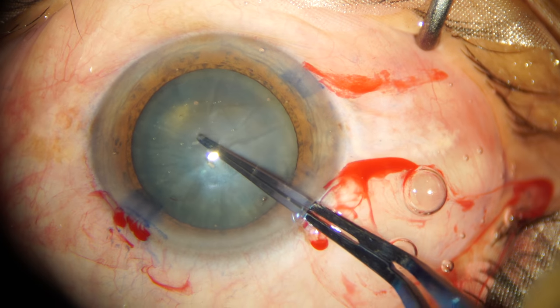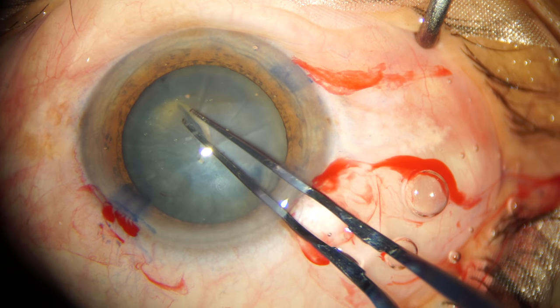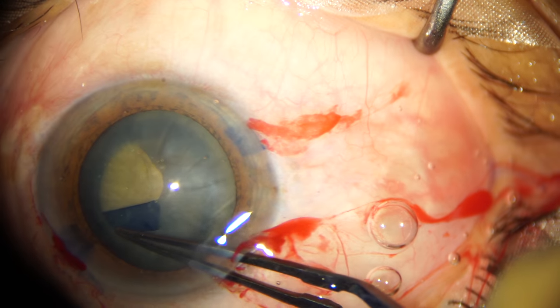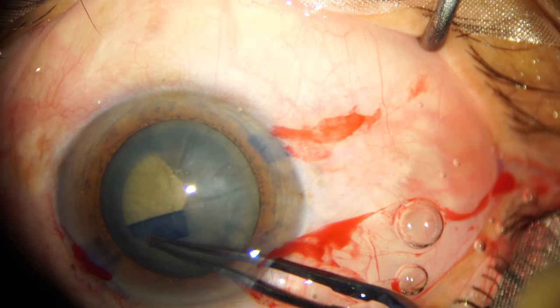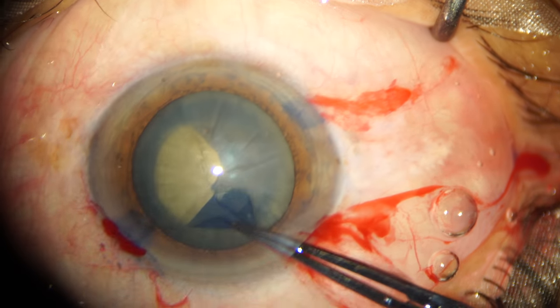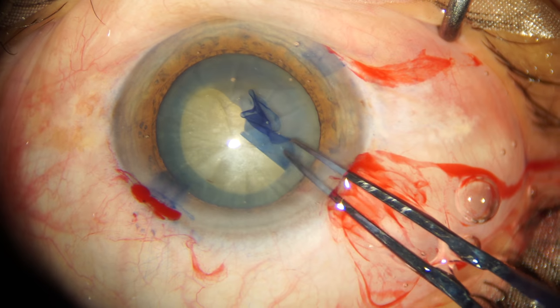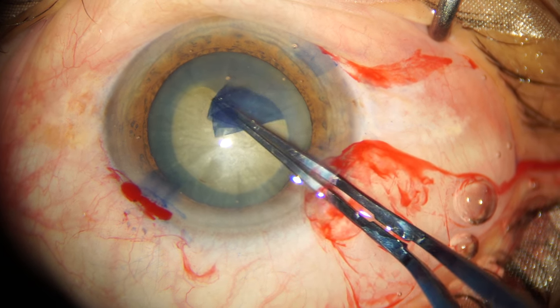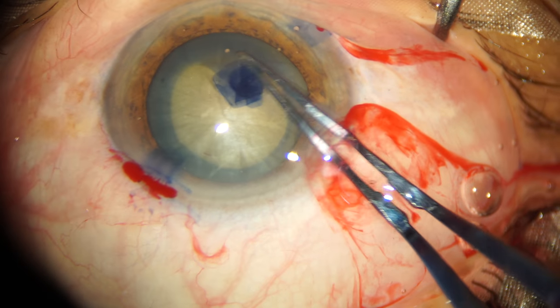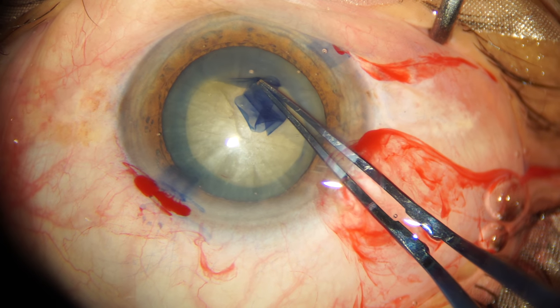I initiate the capsular rhexis with the utrata forceps, raise the capsular flap, and then bring it around in a continuous curvilinear fashion. I always try to grasp the capsular flap as close to the tearing edge as possible, especially in a grade 4 or grade 5 nucleus where the lens is quite swollen. So far, I've completed about three-fourths of the capsular rhexis and I'm pretty confident I'm getting a circular capsular rhexis.